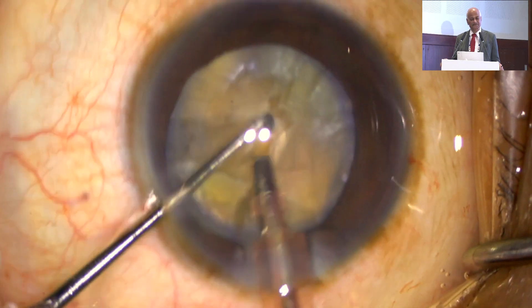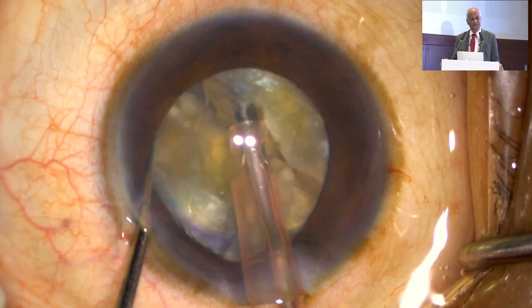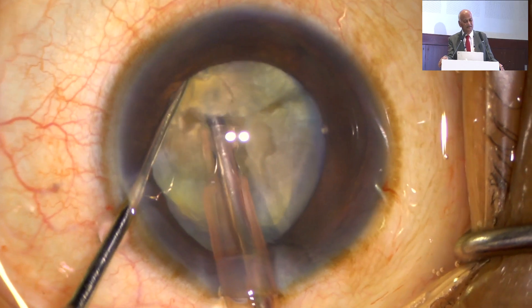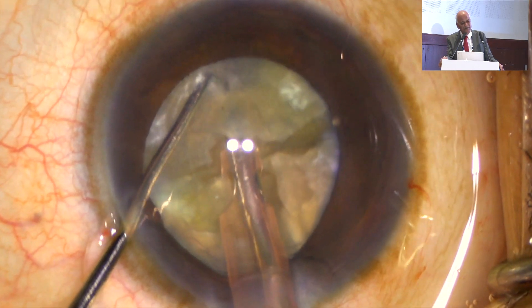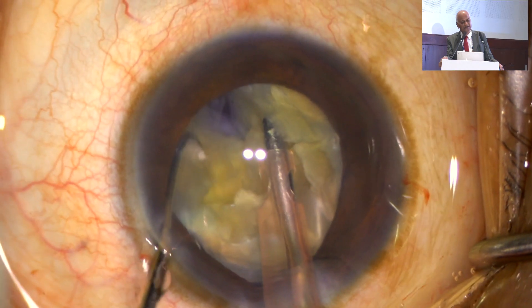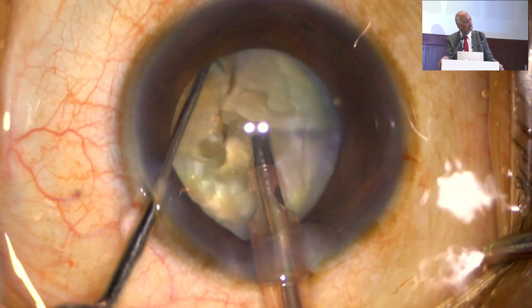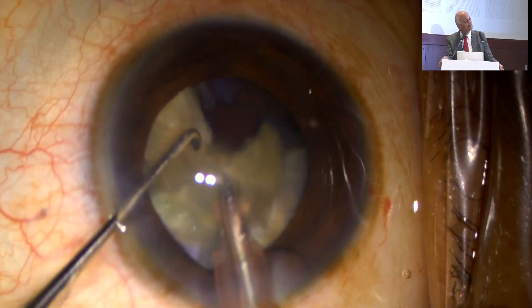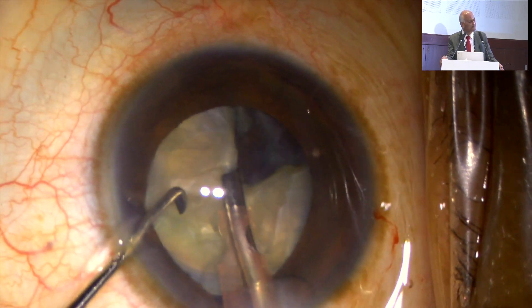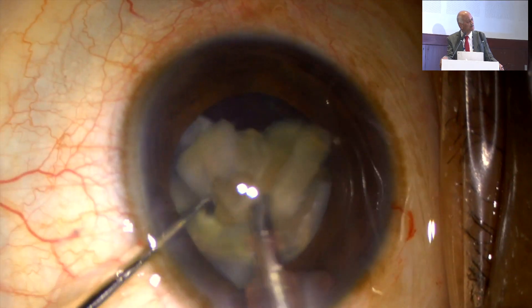To avoid pressure on the posterior capsule, we should do a slightly larger rhexis in such cases. You will see how I am handling this case. See, I am going down — my tip properly goes down, not horizontal, slightly slanting. And see here, these are the fibers behind — leathery fibers. Unless and until you separate those fibers, you should not go to the piece. What I am doing is completely separating the piece.